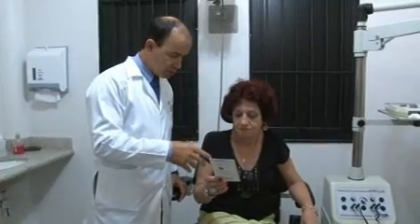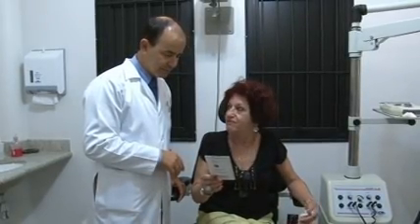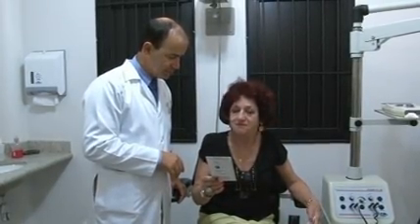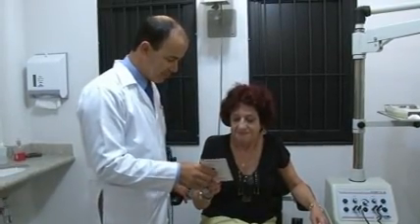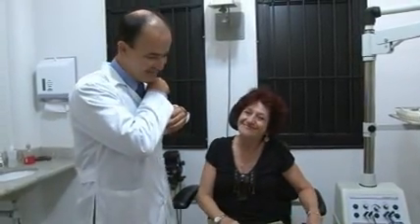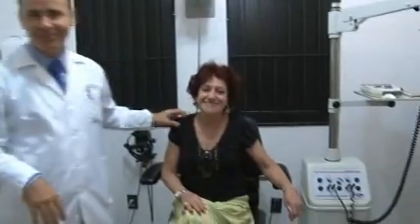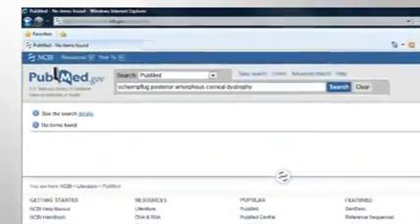A month later, the right eye's undesired myopic refraction was addressed by photorefractive keratectomy enhancement. Her postoperative manifest refraction and uncorrected visual outcomes were similar for both eyes, and the patient became very happy. There is no documented explanation for such inaccurate measurements in patients with PACD.